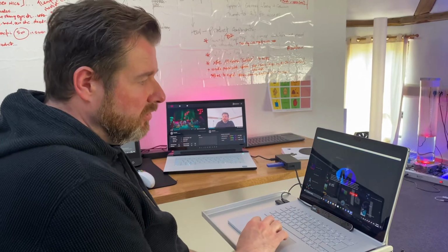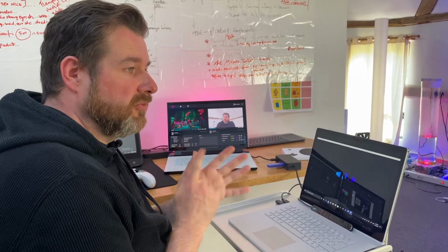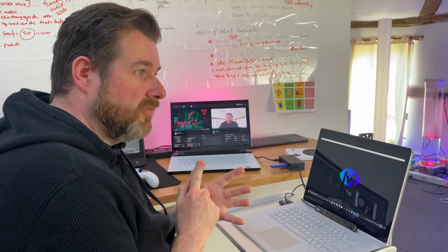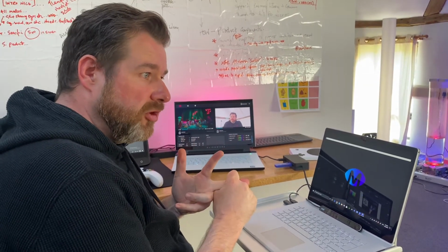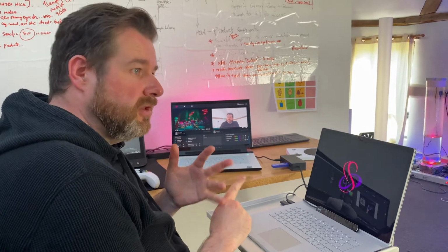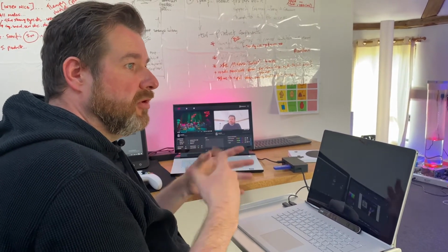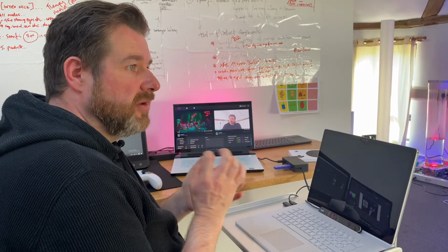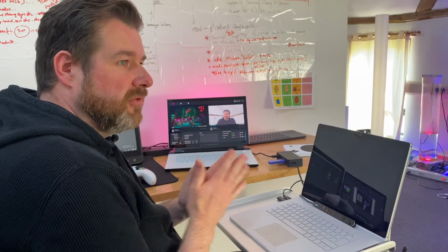Okay, so in this video, I'm going to show you how we can go from working with someone who's at an arousal level through to getting some attention, through to focusing on objects, tracking across the screen, responding to voice objects, and playing with a whole bunch of different access methods that would enable us to explore how someone might interact with assistive technology.